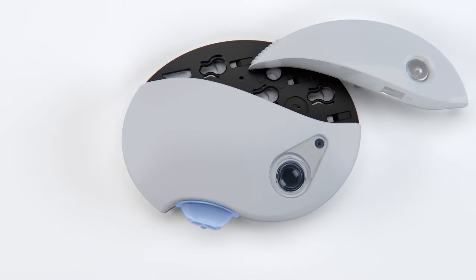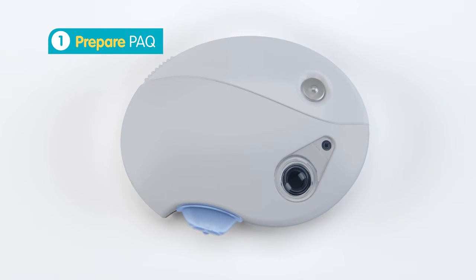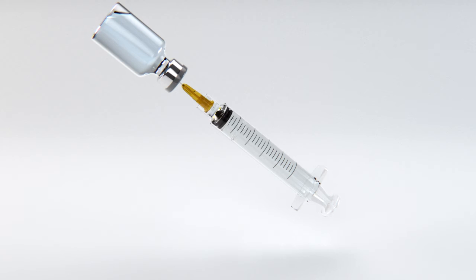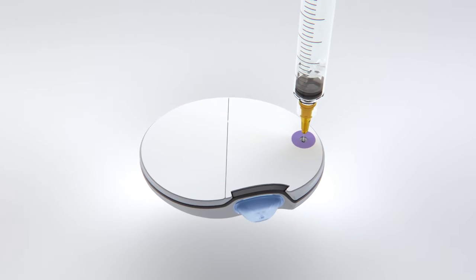To prepare PAQ, begin by connecting the messenger unit onto the insulin infuser. A green light and vibration confirms the connection. Then draw insulin with the supplied syringe and fill the infuser. PAQ is now ready.